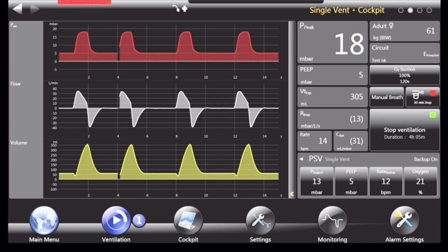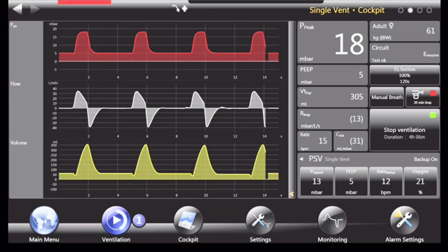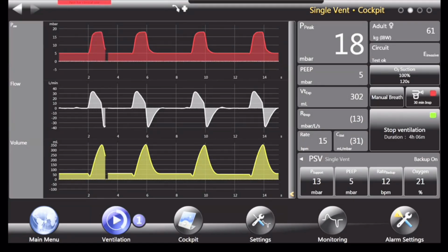So you get the full feature set and also monitoring set via PC. But currently in the initial version, we mainly display the settings there. But they can also be retrieved from the simulator directly.